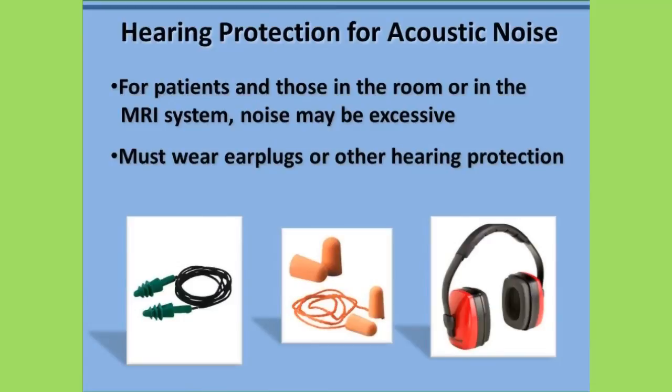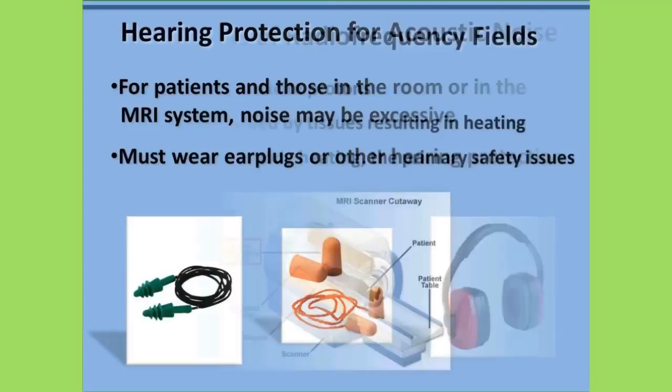Because excessive noise is known to be one of the most common causes of hearing loss, whenever there are loud noises present, it is important to provide patients and other individuals with hearing protection. If healthcare professionals or other individuals must remain in the scanner room during the MRI procedure, they should always wear proper hearing protection in order to prevent problems associated with acoustic noise.